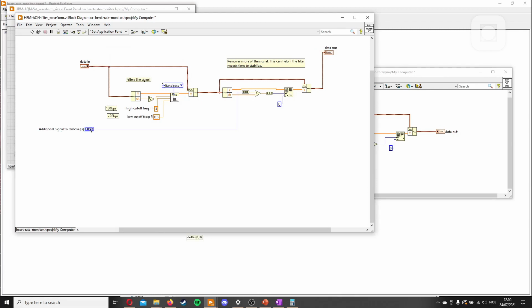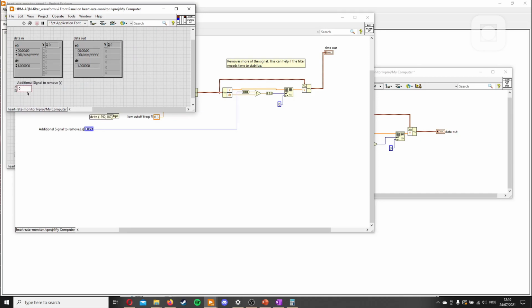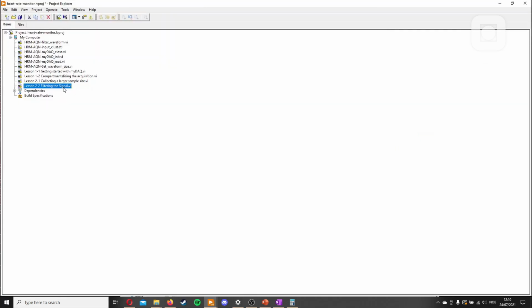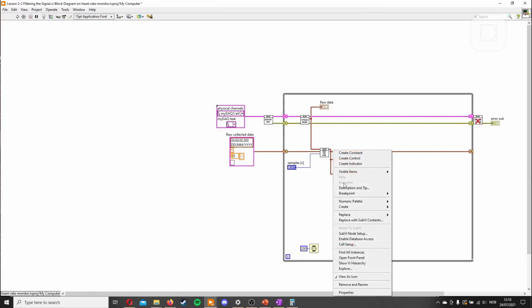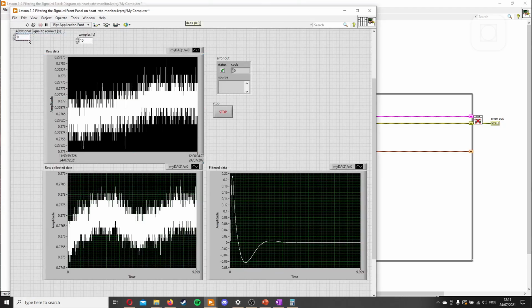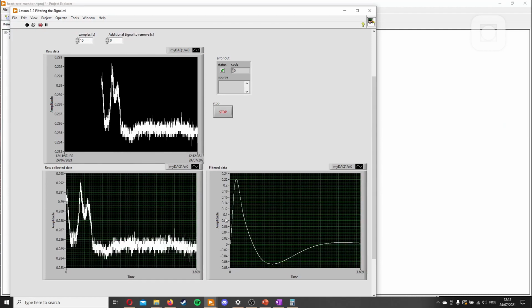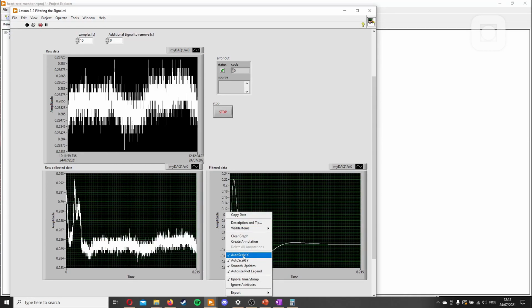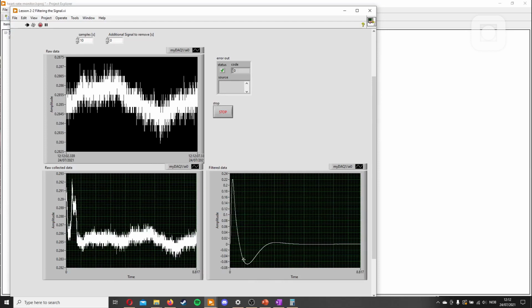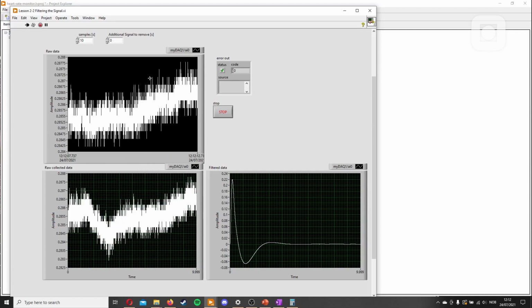We also need to map this one to an input. So let's do that. Just put it there and then move it so it's where the input is. Go back to our VI, filtering the signal, and make a controller, create controller. And there we go. So let's start it now. We see the same wave here, and just to show you what it does, I'll stop the auto scaling of the y-axis so that this is fixed. And now we see it stopped around the middle here, which is 5 seconds.